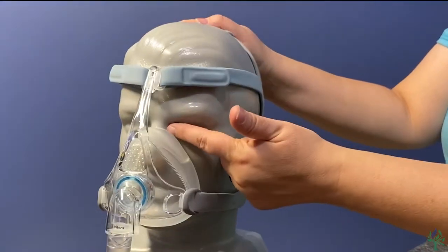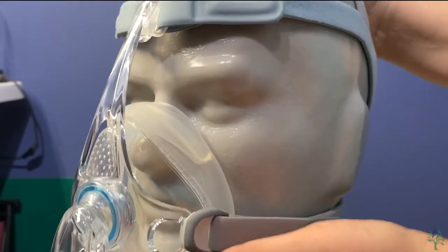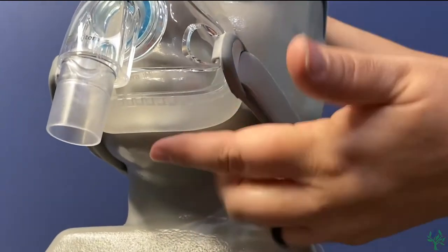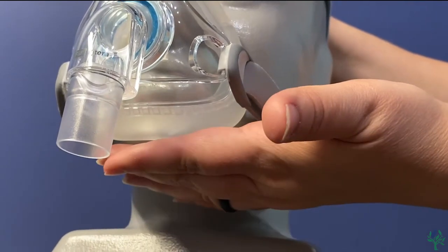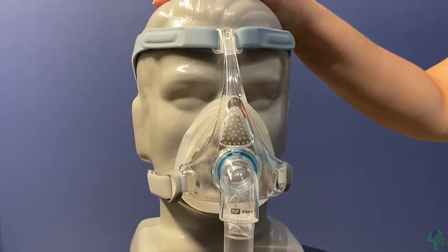You do want this cushion to sit right across the bridge of your nose — you don't want it too far up or too far down. You also want the bottom of this cushion to sit between your lip and your chin. If it's any further down, go ahead and adjust up here to pull that entire mask up. And that is how you fit the mask.